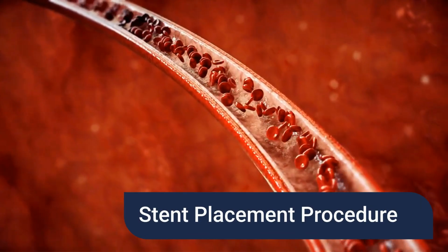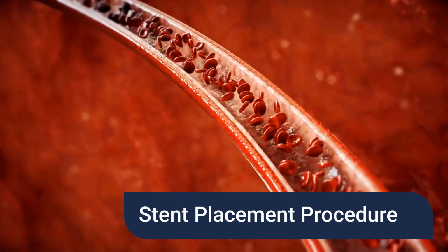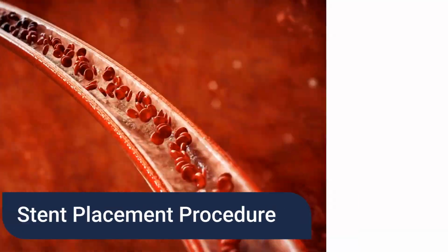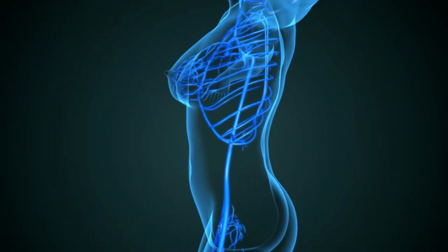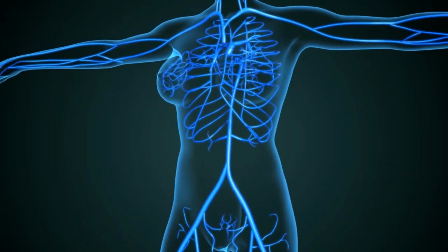Welcome to our in-depth look at the stent placement procedure, a vital intervention for maintaining heart health. Before we dive into the procedure, let's understand what stents are and why they are so crucial in modern cardiology.